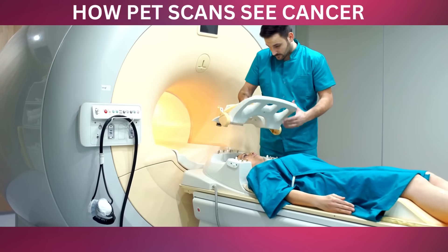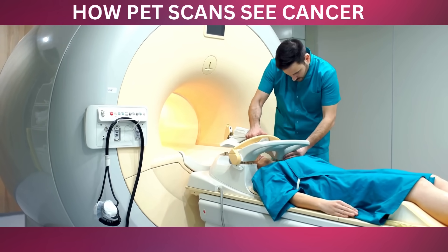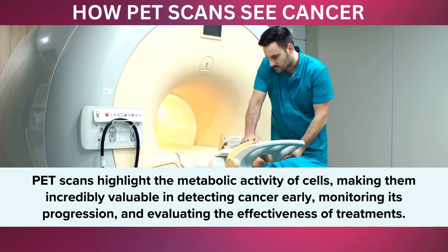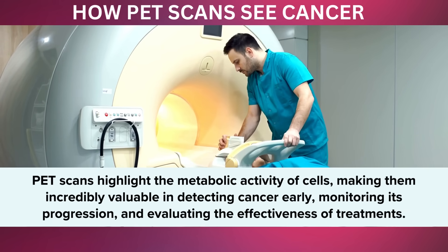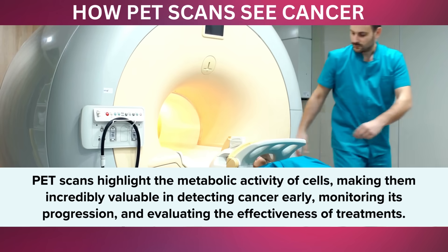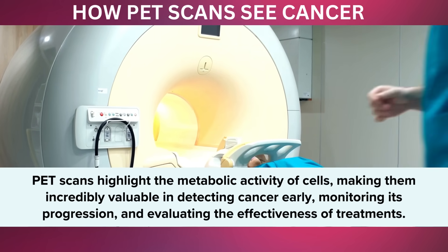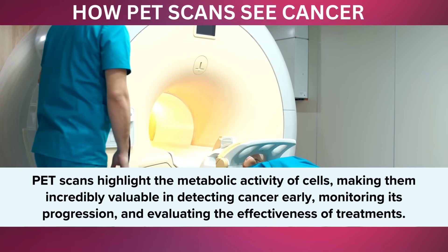Unlike traditional imaging techniques that show structures and anatomy, PET scans highlight the metabolic activity of cells, making them incredibly valuable in detecting cancer early, monitoring its progression, and evaluating the effectiveness of treatments.